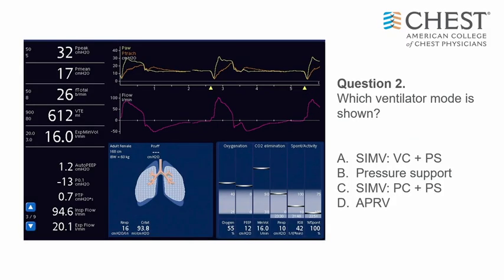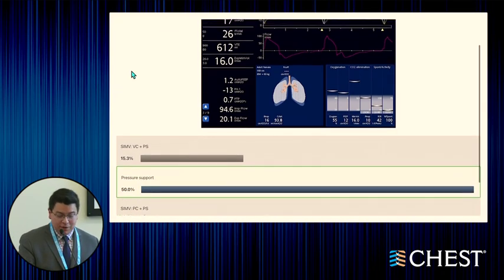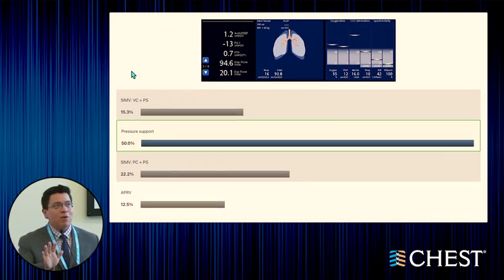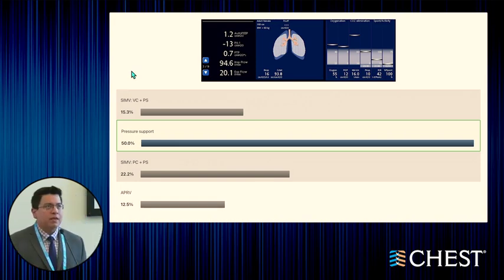Very good. Excellent. So let's scroll down here and see. All right, well, I'm not winning today. This is great. You are all winning. That's phenomenal. So this is an example of pure pressure support ventilation.